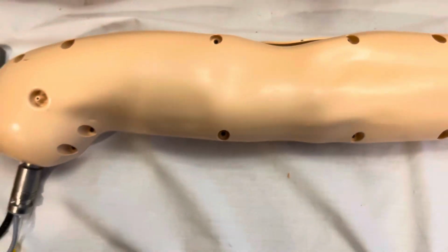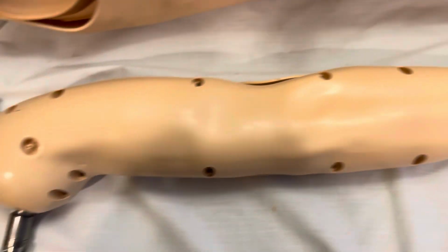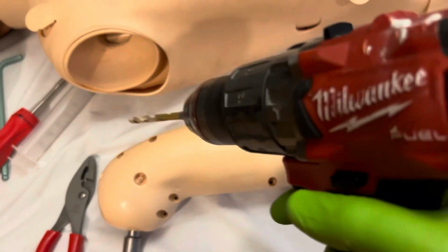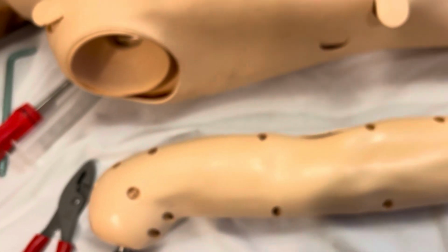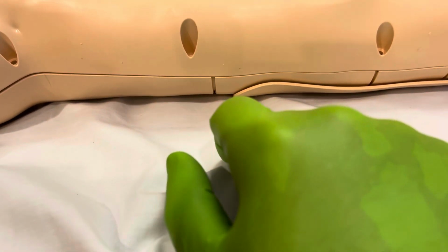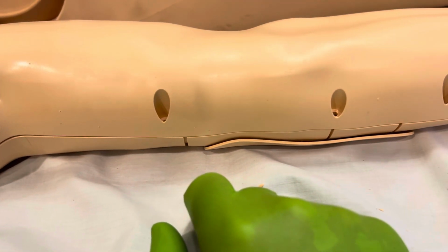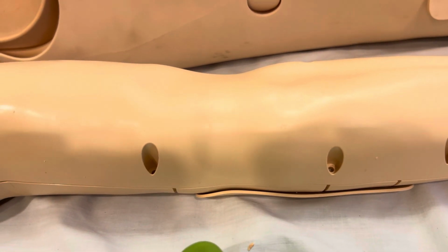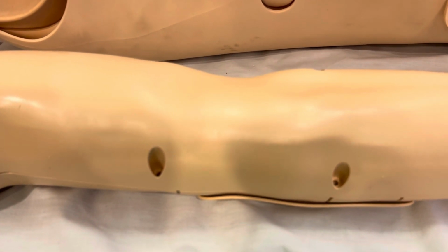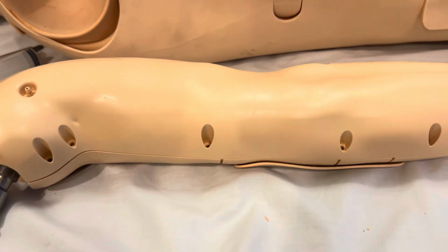All right, now that my casing is tight together, well, it is if I hold it, and I know none of my hoses are sticking through the sides there, I'm going to go ahead and replace those 15 screws. I'd recommend not using a cordless drill or cordless screw gun, because you can put too much pressure on the casing very easily, and you can cause stress cracks, and it'll just keep on cracking. If for some reason you absolutely have to use a screw gun, I'd put it on setting 2 or 3 at the highest, but I'd recommend not doing this.